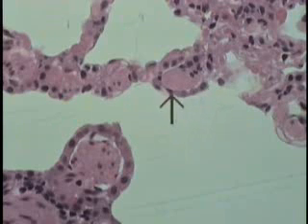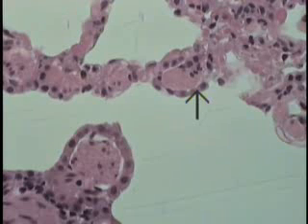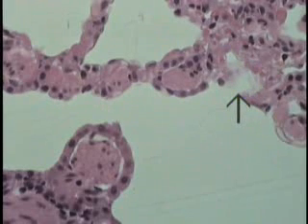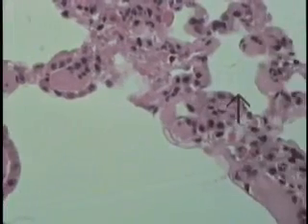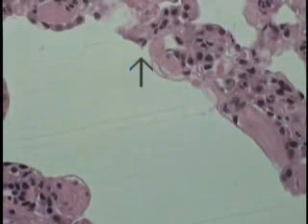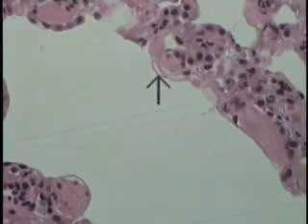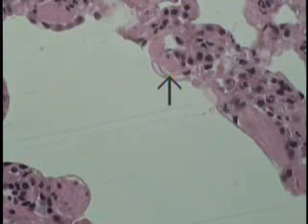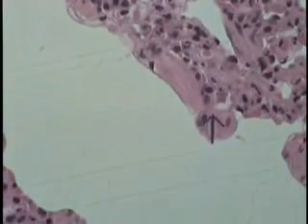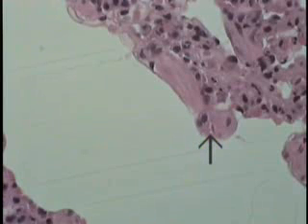The cuboidal lining epithelium of this respiratory bronchiole is shown here, and though it has exudate and some material in it, another alveolus is shown here. This type of transition will repeat itself over and over again. Here we have the alveoli that are stretched out. You can see this is the luminal lining, this is the capillary. This surface here will be covered by type 1 cells as further down. And then we get perhaps another little bunch, though it's ragged, of these cuboidal type cells that were jagged up. And that's about the length.